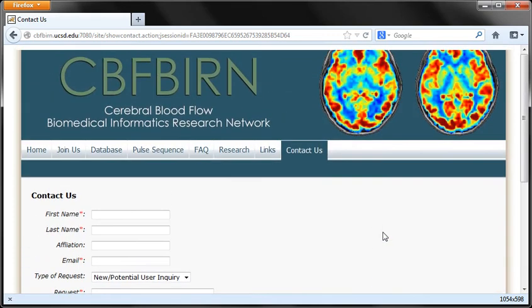You can think of your project as a big binder where you store all of your data for a given study. For example, your project contains the raw ASL data and clinical assessments that you upload for all your subjects. The project also contains the processed CBF maps and group analysis results that are generated after processing your raw data through the CBFDAP processing pipelines.